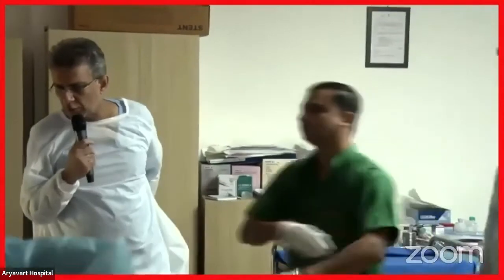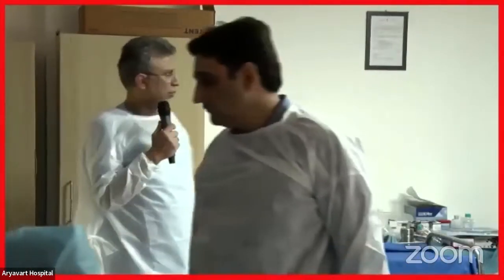Okay, so we are talking of autoimmune hepatitis in this case. Kapil, you have got 20 minutes maximum to do the case, because at 4:30 we have the lecture of Dr. Anand Sahay, and then the last lecture is by Dr. Kapil Jamwal himself, on US in portal hypertension. So you have 20 minutes to show where, why, and how you are going to proceed with the liver biopsy. Start the scope, and what needle are you going to choose, the 19 gauge needle?